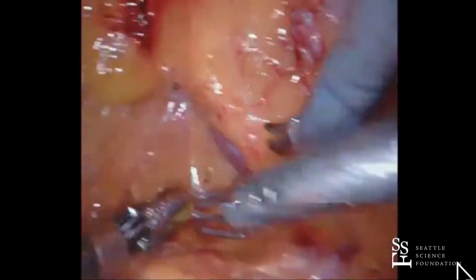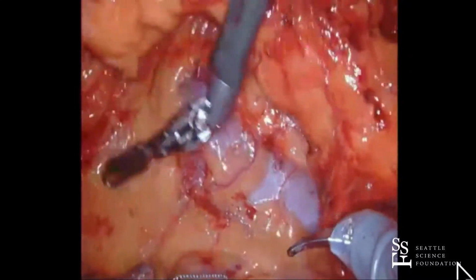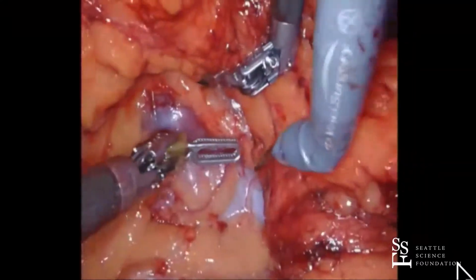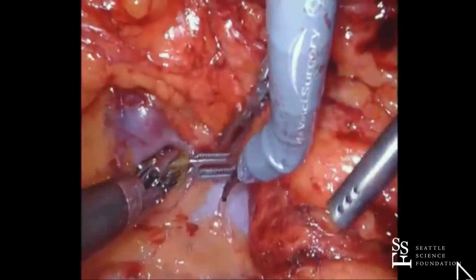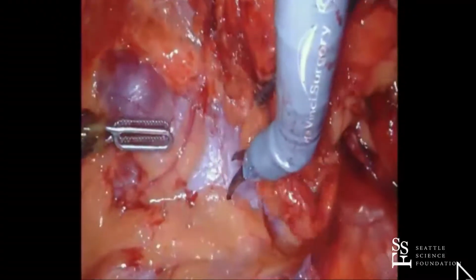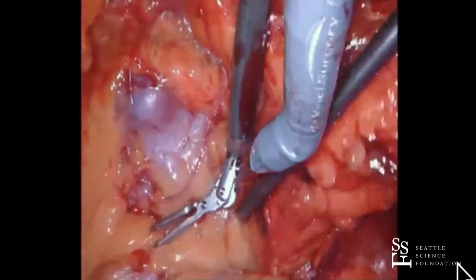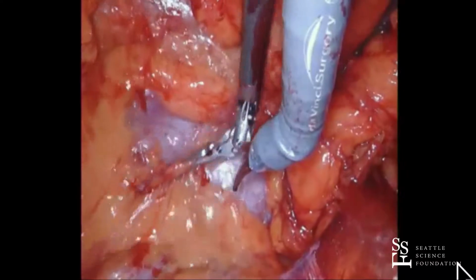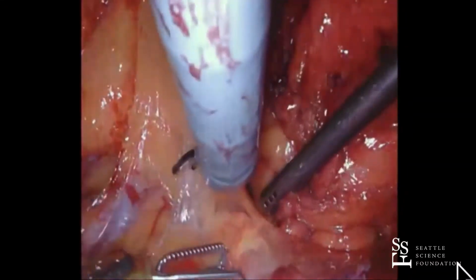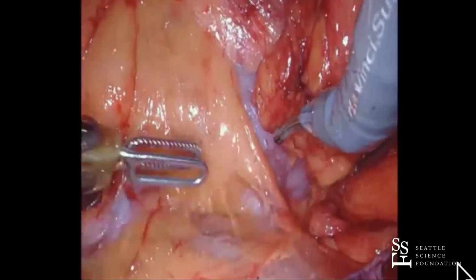And obviously that's true of your learning curve with any case. You're always going to start with the easier one. So when you start doing retros, do the same thing, because the access is going to be the hardest part for you when you're starting out. If it takes you a long time to get the access and you're really exhausted and now you've got a really tough tumor to do, that's probably not a good combination. But if you start with an easy tumor, nice posterior, not too medial, the more medial the tumor, the more you've got to really lift that kidney up and you're going to be kind of working upside down. So it's better to have something that's directly posterior rather than posterior medial. So start with an easy one, and that way you can really focus on getting the access, getting the port placement, and then the rest of it is easy.